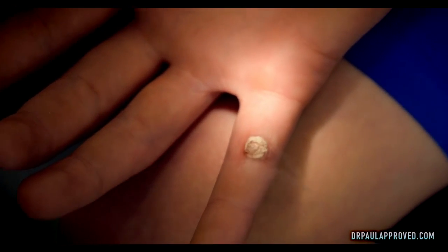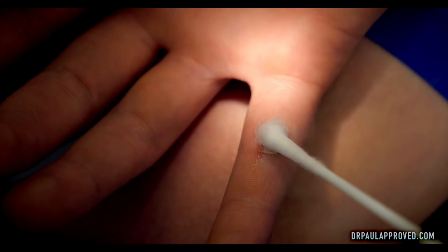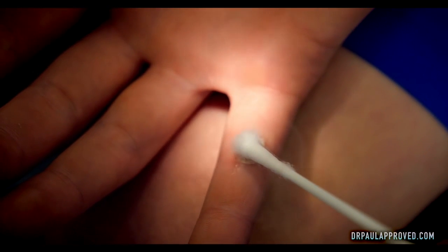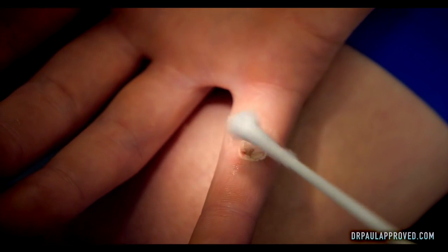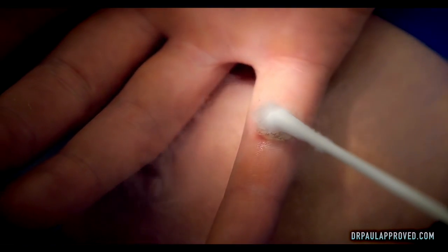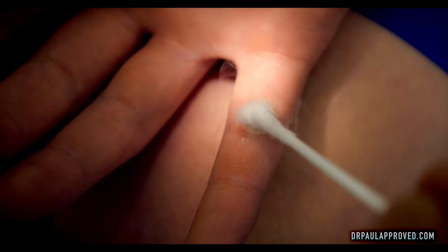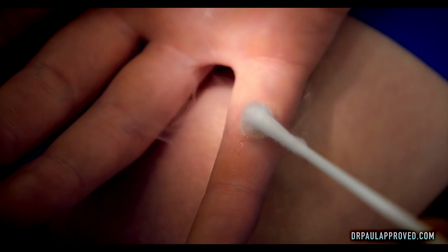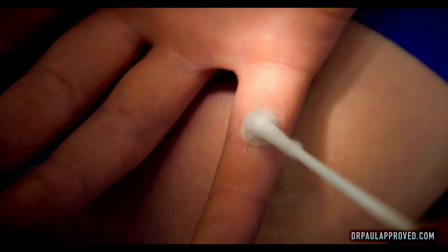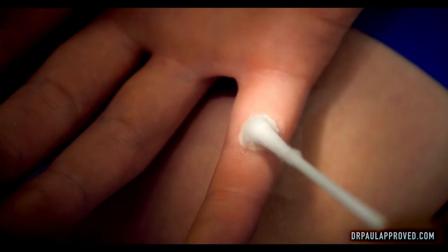Does this hurt yet? A little bit. Alright, it's a fairly big wart. What we want to do is freeze the entire wart and about a millimeter of normal tissue. You can start to see we're close to a millimeter of normal tissue frozen. That usually means we've frozen through to the depth of the wart. Since you've done this three or four times at home, I'm gonna give you an extra half a millimeter of pain. Alright, that is a nice freeze.